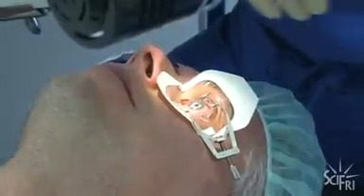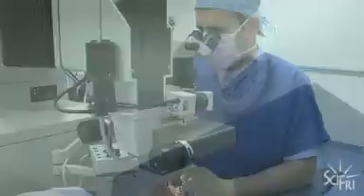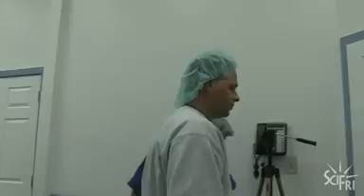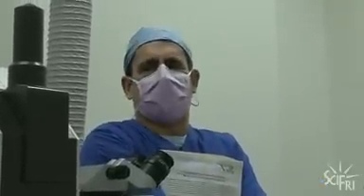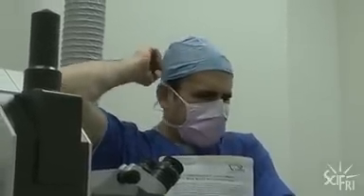After ablating, Dr. Vale folds the flap down. Then we use a sponge again to smooth the flap out and put it back where it belongs. That piece of tissue is actually a natural bandage. Now, Dan, would you have been able to see that clock without your glasses before we did your treatment? No. I mean, it is like I'm underwater though. Exactly. But yeah, I wouldn't be able to see that normally. The effect you get is really pretty much immediate. There's a little bit, because there's swelling, that people think that they've been in a swimming pool too long afterwards, but generally it's really gratifying for patients in particular to know that they made the right choice, because as soon as they get off the chair they can see better already.